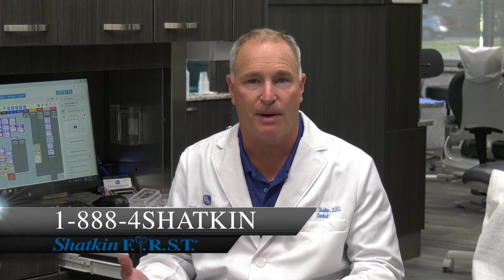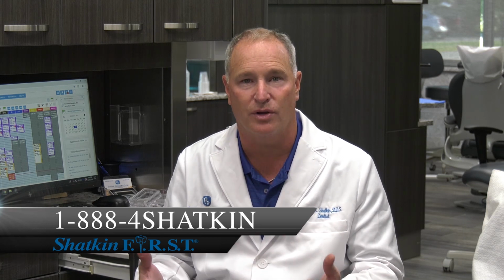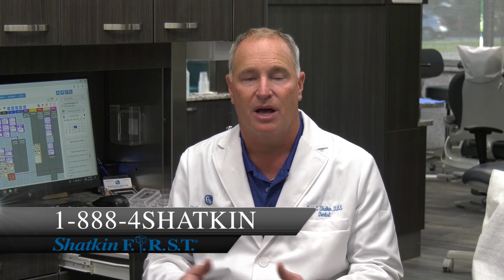I hope this information was helpful to you. As always, you can reach out to myself, Dr. Powers, if you have any questions at all about the process of doing your fixed roundhouse cases. We are doing more and more fixed roundhouse restorations on mini implants. Generally, I cement them, but I do a lot of fixed detachable restorations that we call our fix on 6. We say 6, but we usually use 8 to 10 implants.